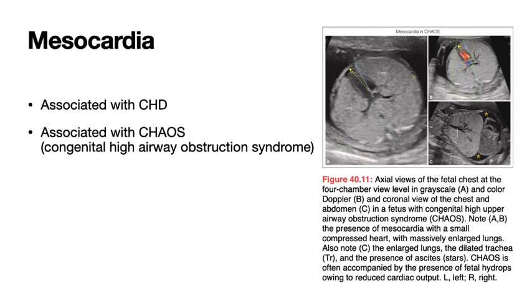Now, if it can't get out, the lungs start to blow up like little balloons, but they're not really balloons, they're more like sponges. So the sponges get overinflated, and when all those millions of alveoli get dilated, they get very echogenic. So the picture on the right shows 2 overinflated lungs because of an airway obstruction like laryngeal atresia.